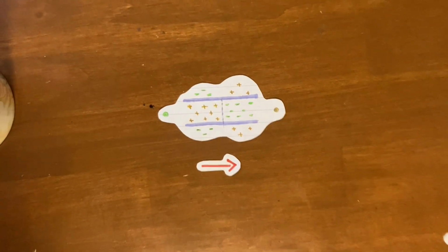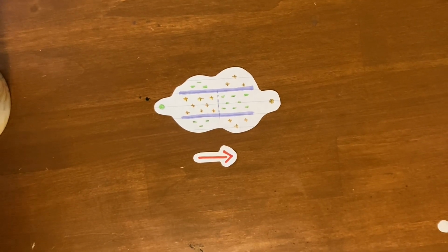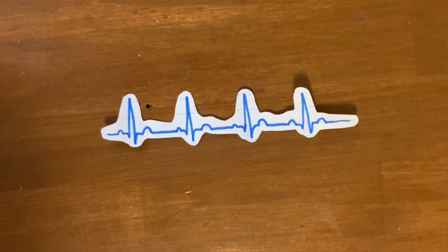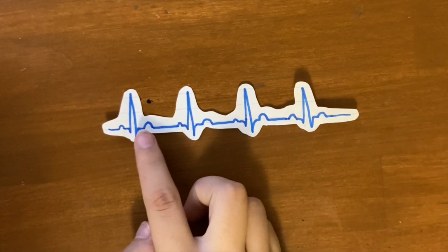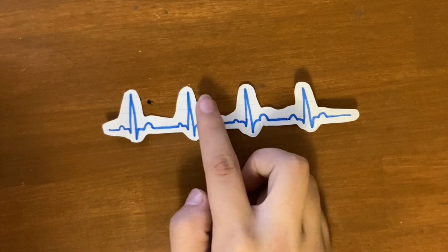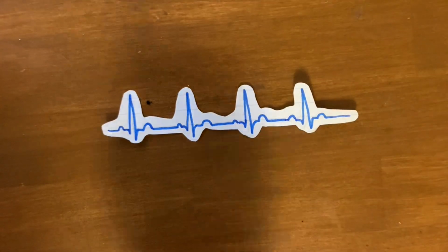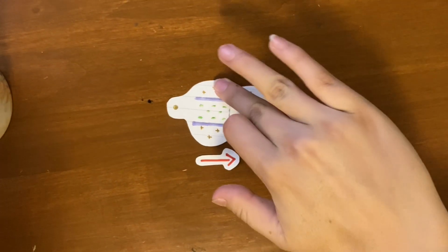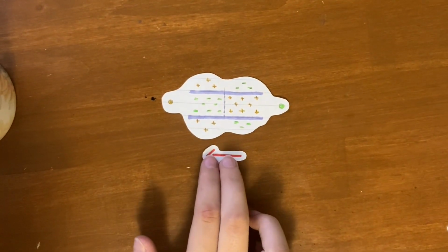This shift in charge is significant because it generates an electrical signal that is reflected as a positive deflection on the ECG. Essentially, as the heart muscles depolarize, it creates this dipole moment. The ECG records this change in electrical activity as an upward spike in the graph. And the opposite happens for the repolarization. The dipole moment switches and the ECG records it as a negative spike.